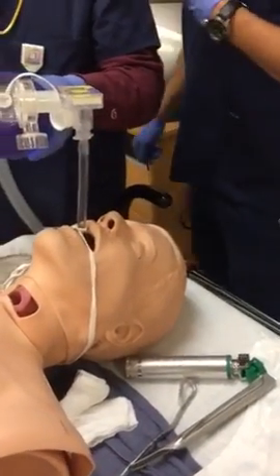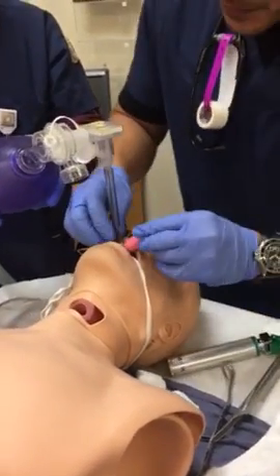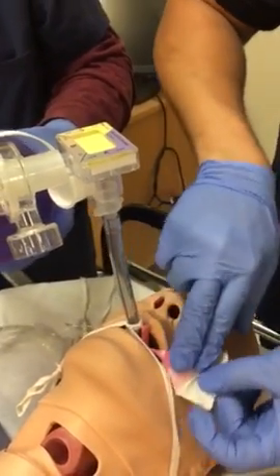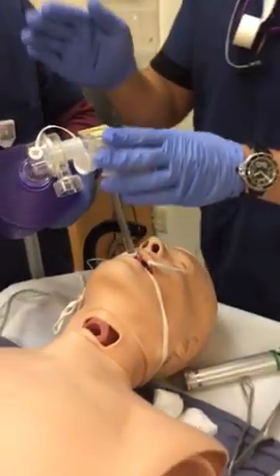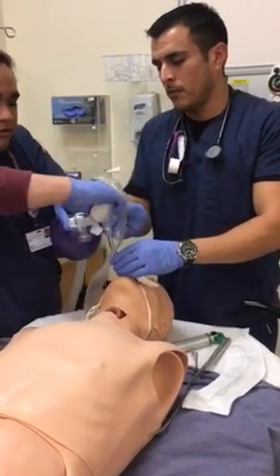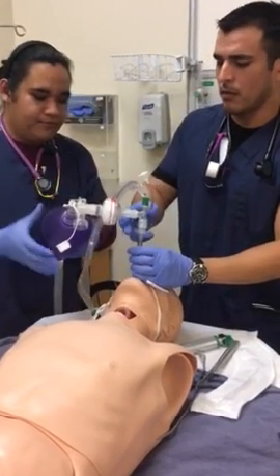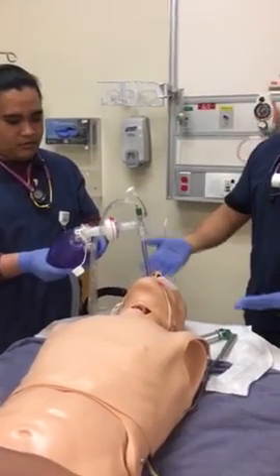After the airway is secure, what we want to do is place our bite block. I'm not going to actually stick it, but we would place our bite block, and we would take this off. Back it up in 3, 2, 1. Take that colorimeter out. So now we could also take it off the bag, and we could place the patient on the vent.